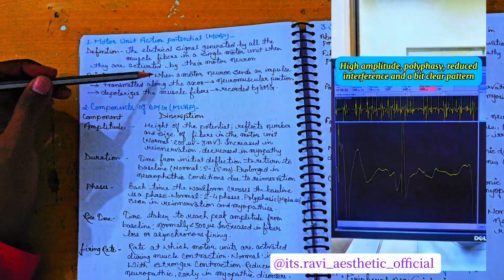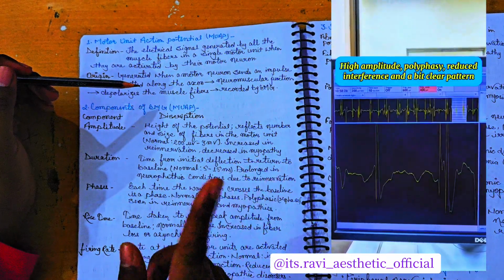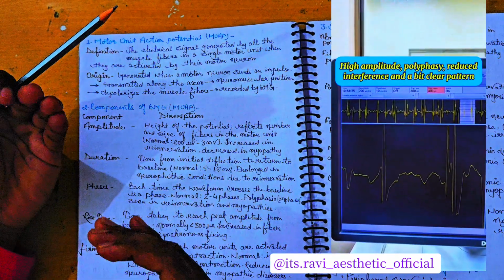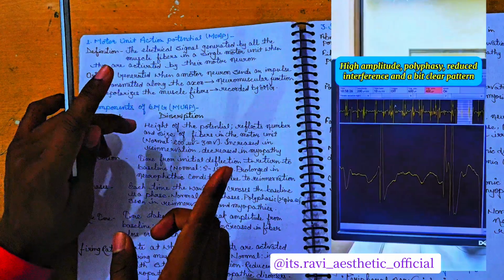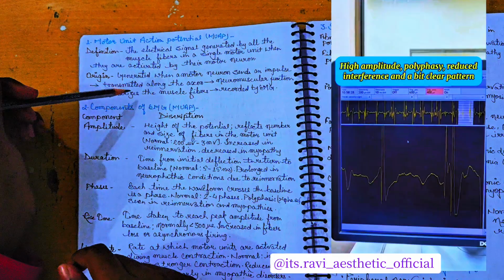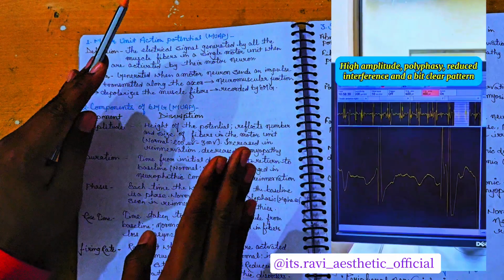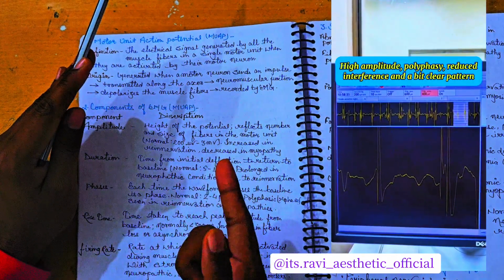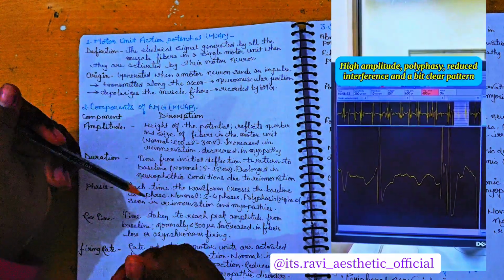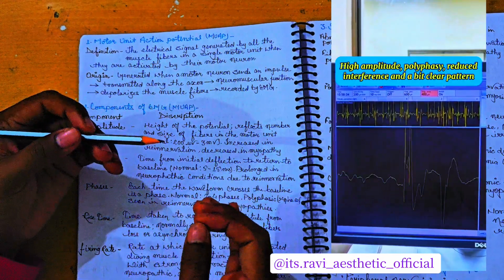So what is its origin? It is generated when a motor neuron sends an impulse. It happens when the neuron sends the signal to the skeletal muscle, transmitted along the axon to the neuromuscular junction. That is where we find the electrical signal, which depolarizes the muscle fiber and is recorded by the EMG. In polarization, there are negative charges inside and positive charges outside. In depolarization, a stimulus comes and there is an influx or efflux of positive and negative ions, and the next part is depolarization and repolarization. The signals will be shown on the graph.